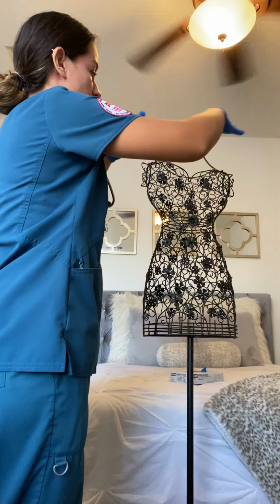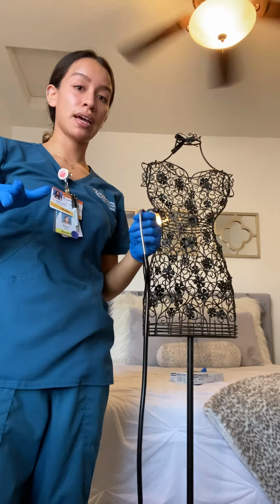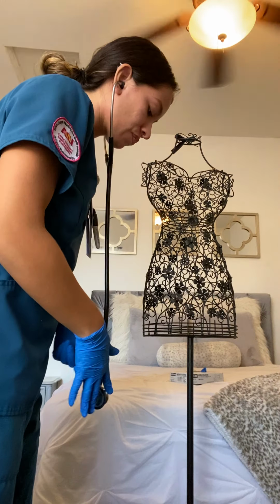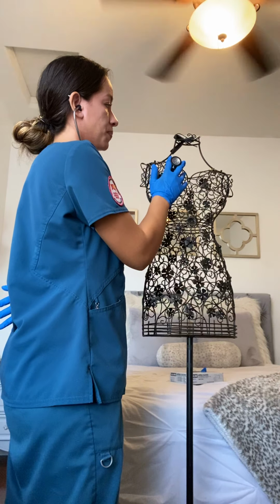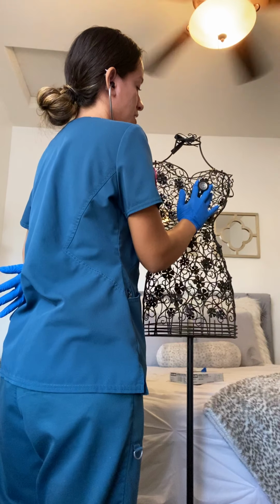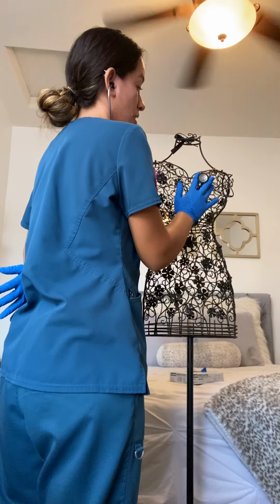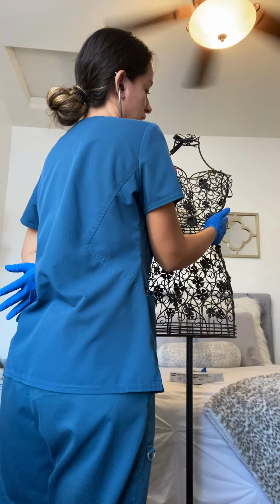So now that I've assessed the top portion, I want to go ahead and listen to her heart, and I'm going to do APE to man. So I will listen to her aorta, the pulmonic, tricuspid valve, Erb's point, tricuspid valve, and mitral down here.